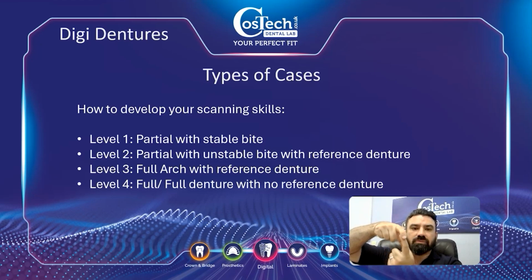For crown and bridge, it usually works fine because you can work on a quadrant. When you're working with the denture, you want to make sure that it's not tilted. Sometimes what we experienced is we end up with open anterior bites, because where it thinks the bite is is actually slightly incorrect. If you carried on with the bite more easily, you would get a better registration. So with a stable bite, same with any bites that you're taking, take as much as you can. It doesn't matter if you take basically the entire arch.